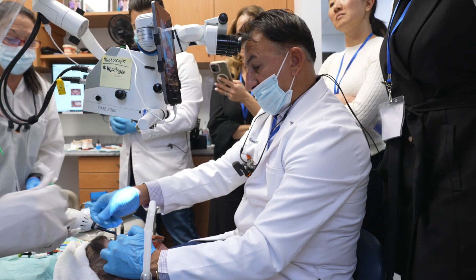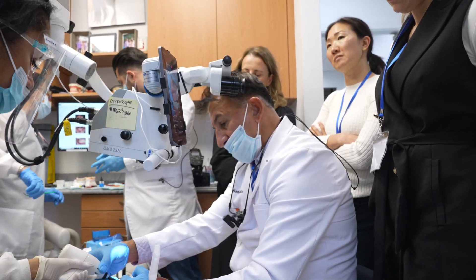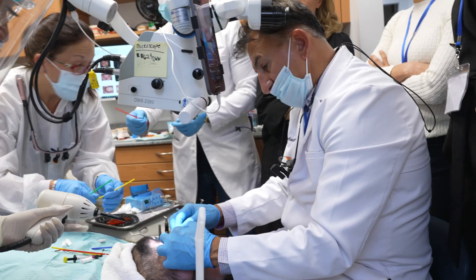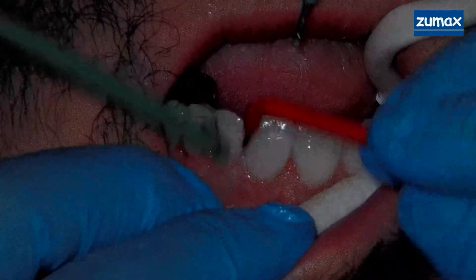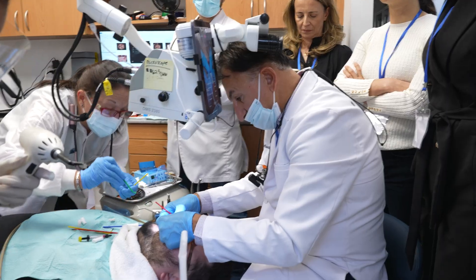Let's tack in number 12 so we don't have that problem. Now that we've got the ones in the back, I don't have to worry about them. I'm going to the front and really make sure my 8 and 9 are in perfect position, because that's the whole case. If 8 and 9 are rotated, we're in trouble.